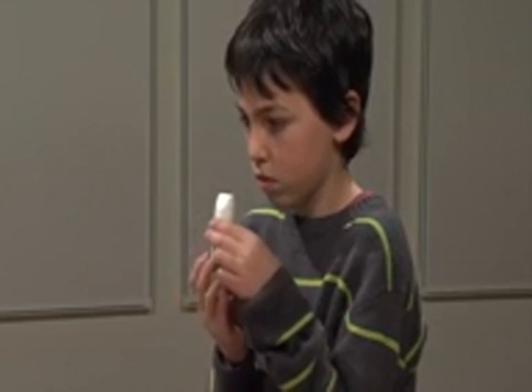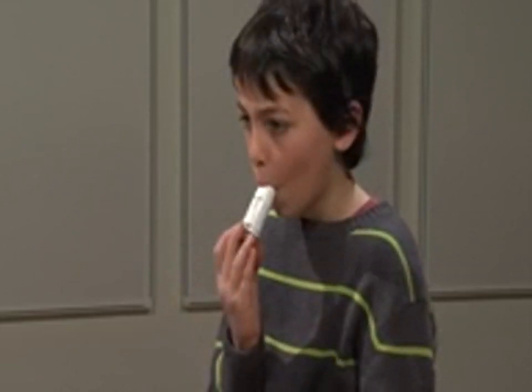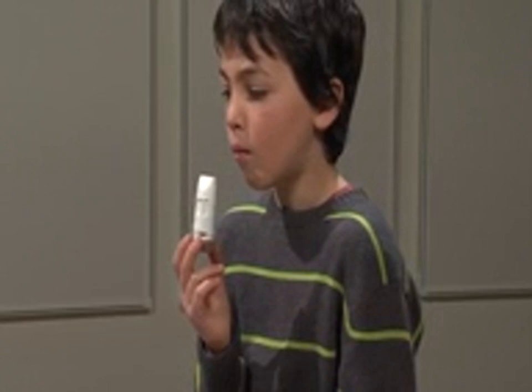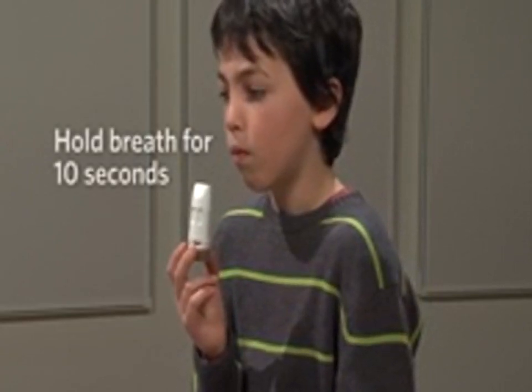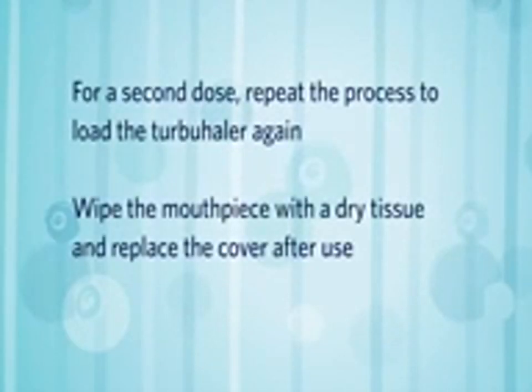Breathe out gently, away from the mouthpiece. Put the tip of the mouthpiece between your lips to form a good seal. Breathe in as quickly and deeply as you can. Remove the Turbuhaler from your mouth and hold your breath for 10 seconds. Breathe out gently away from the mouthpiece. If a second dose is needed, repeat the whole process. When you have finished, wipe the mouthpiece with a dry tissue and replace the cover.